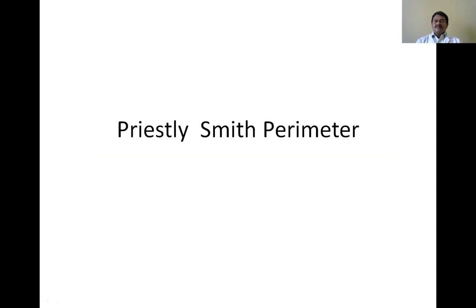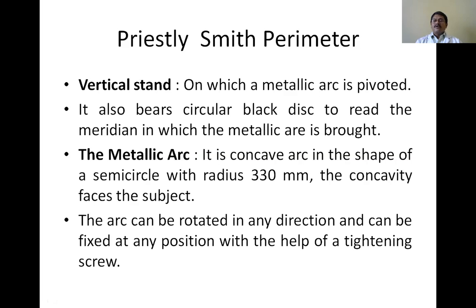Then what is the Priestley-Smith perimeter? This is the perimeter we are using to do the charting of the visual field.